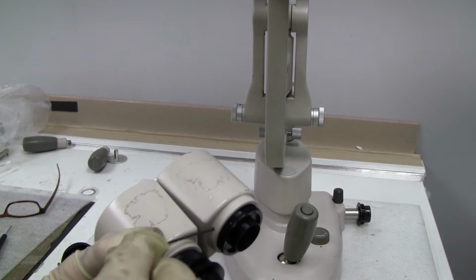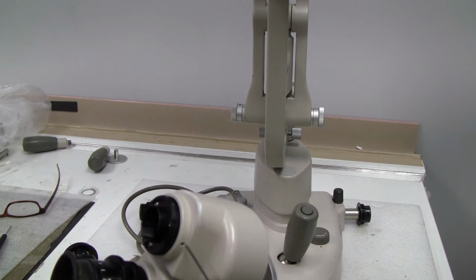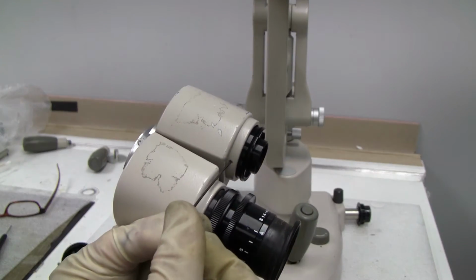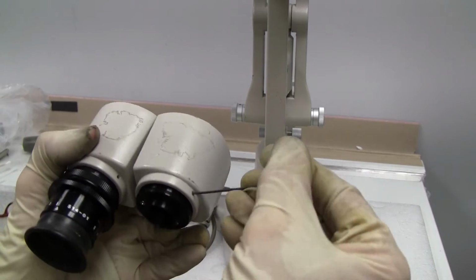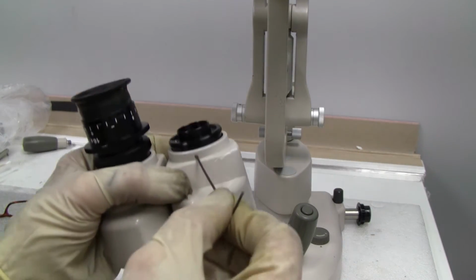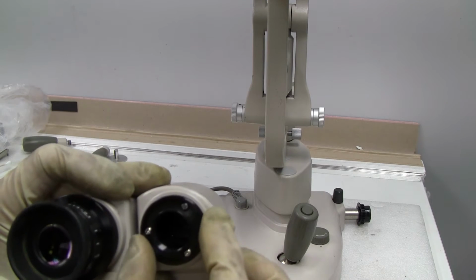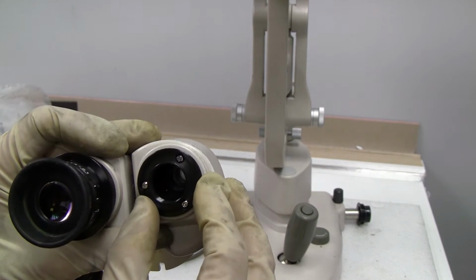Just a little bit. Now there may be paint in there, so you may have to get some acetone to clean them out. But once you're able to get your 1.3 millimeter Allen wrench in there, loosen it up, maybe half a turn or so or more, so that when you have these 3 Phillips loose, your eyepiece will move a little bit.